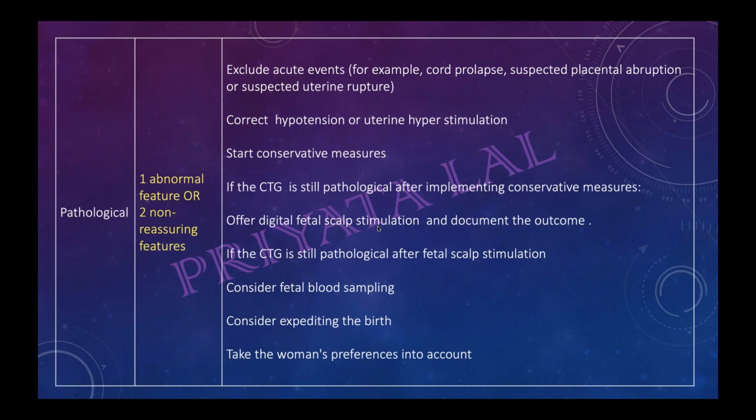One of the questions before asked which one you will do first, offer digital fetal scalp stimulation or fetal blood sampling. The answer will be scalp stimulation. This is the complete hierarchy. I think this is new in the NICE guideline. Before, should we do fetal blood sampling?